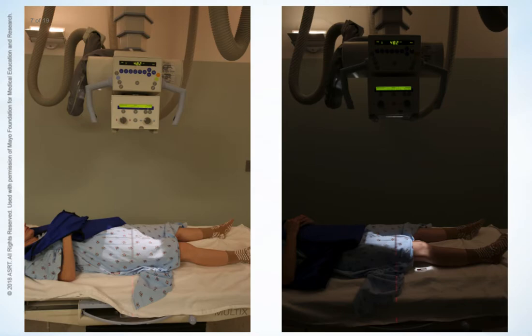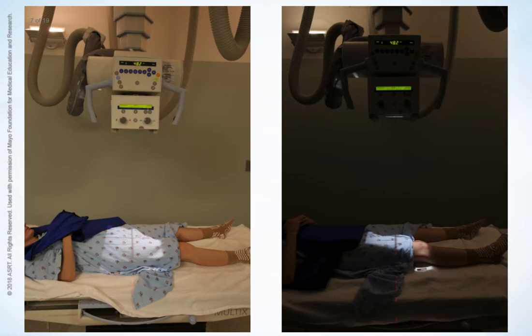The patient's gonads are shielded, and the shield is placed between the x-ray source and the patient. The patient is instructed to hold very still, but no breathing instructions are necessary.